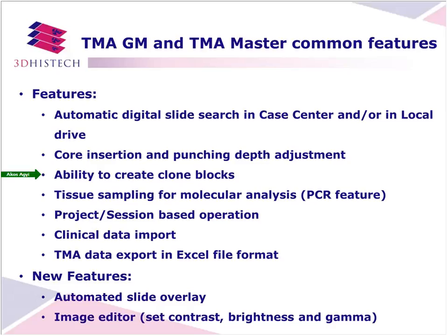With both systems, there is an option to create clone blocks, which means that the users can create almost identical TMA blocks. Both systems have the so-called PCR feature or PCR option. This means that the user can extract some tissue cores for later molecular analysis.